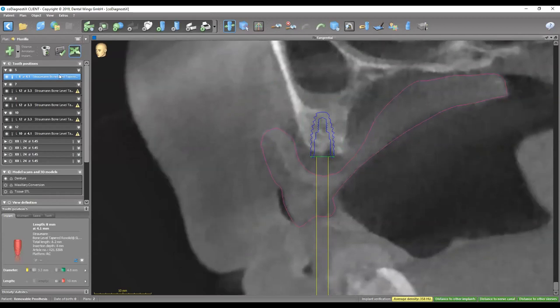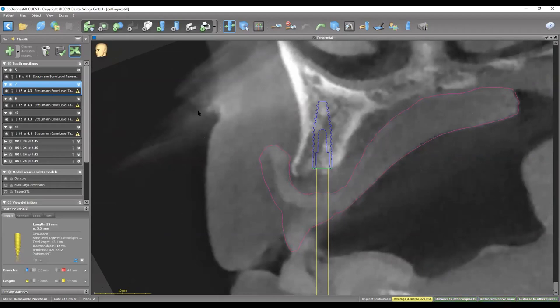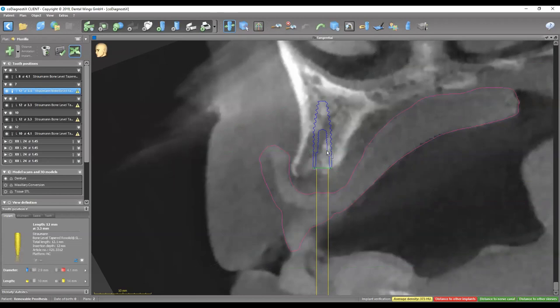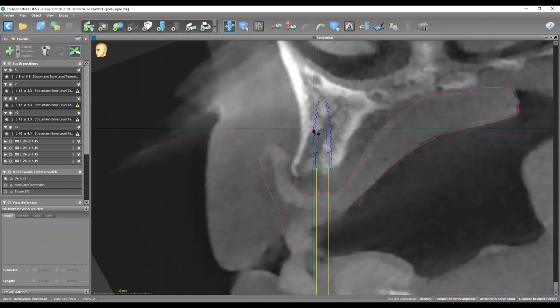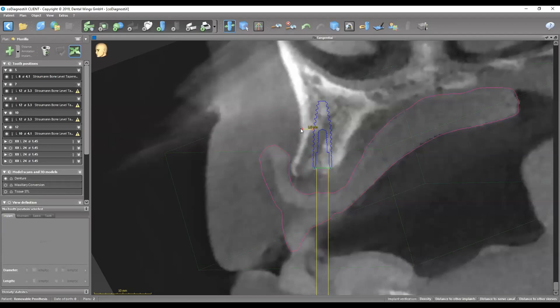Moving on to number seven — a 3.3 by 12. The reason for a 3.3 is that the bone won't accommodate a 4.1 with the recommended 1.5 to 2 millimeter distance away from the buccal and lingual plates. Measuring from the facial threads to the facial plate, that is around 1.9 to 2 millimeters, which is safe enough and would prevent any future exposures.